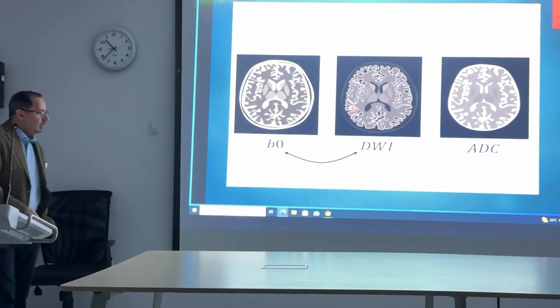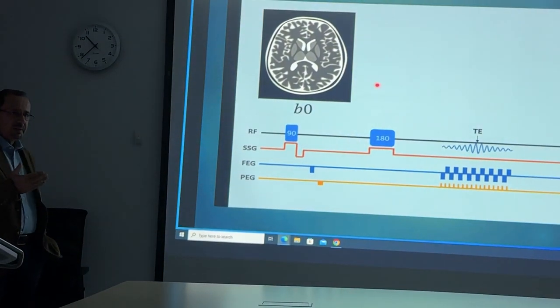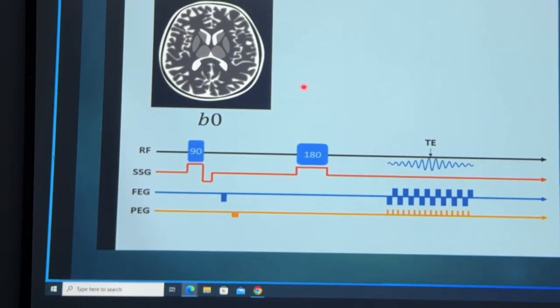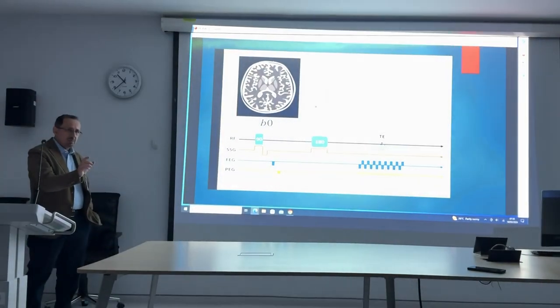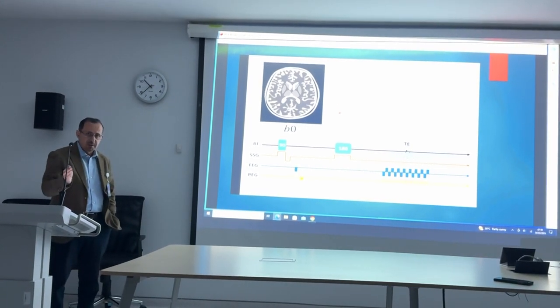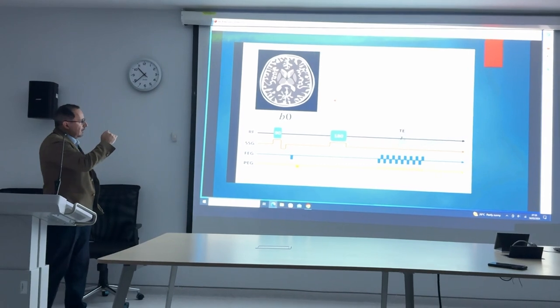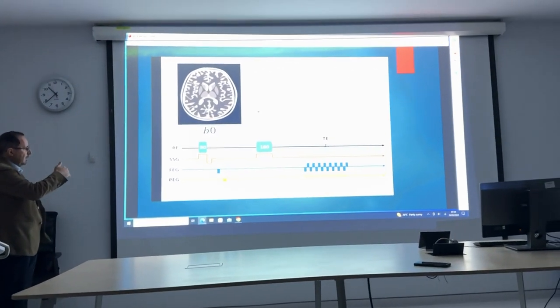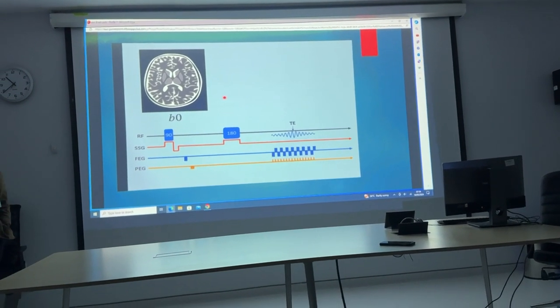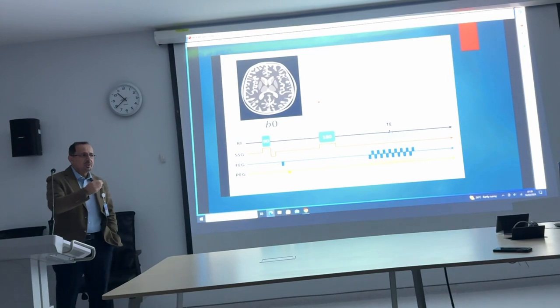Okay? Let's start with the B0. B0 is a spin echo sequence followed by multiple gradients, which means it is an echoplanar sequence. Echoplanar sequence, by definition, is a multi-sequential imaging that starts with spin echo. We give a 90-degree pulse, or excitation pulse, followed by the 180-degree refocusing pulse, and followed by the echo or signal at a certain time, which is TE. After we give this sequence, we give frequency encoding, phase encoding, and gradient sequences to enhance the echo and also enhance plotting the signal on the K-space and computer. We want a very rapid and short sequence to achieve the result.